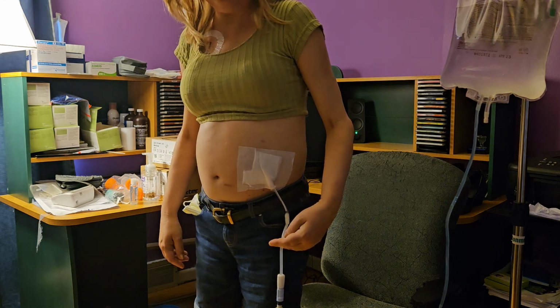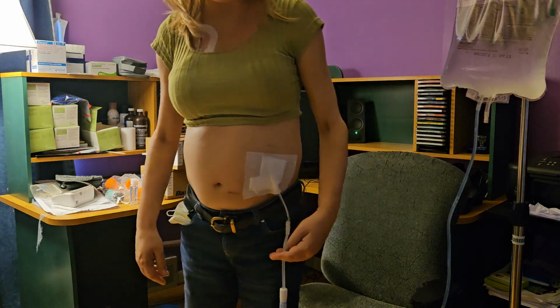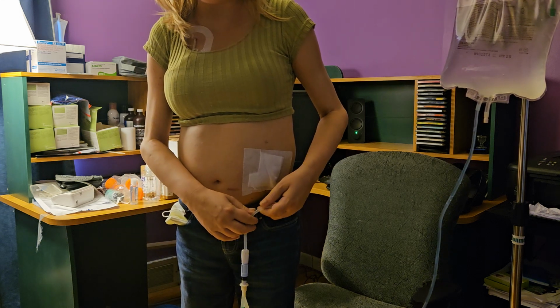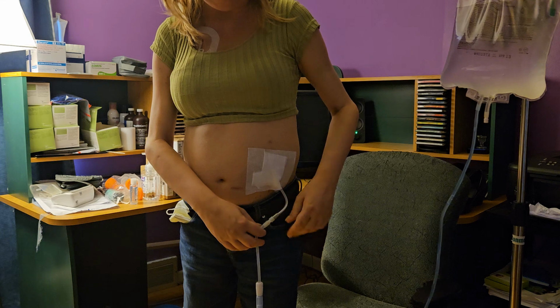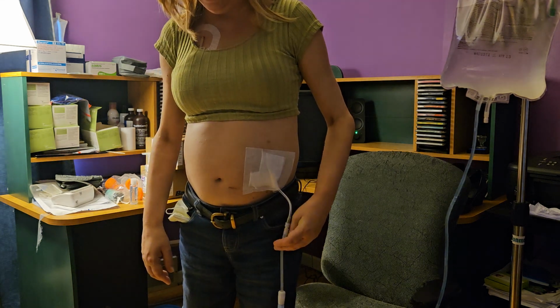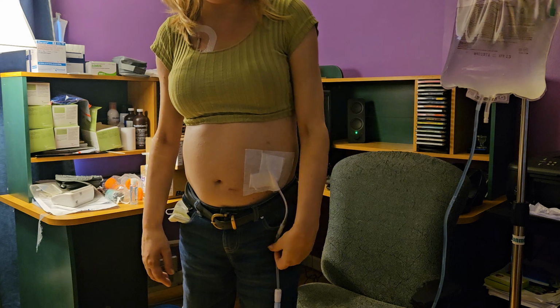You can't really see the fluid draining out. Sometimes I can tell when it's pretty much done because this is no longer warm, because the fluid coming out is warm. Then it starts to cool down when it's draining less. Kind of like peeing.